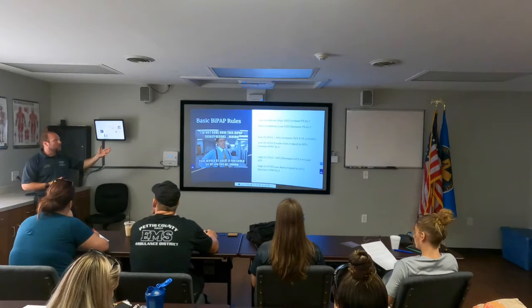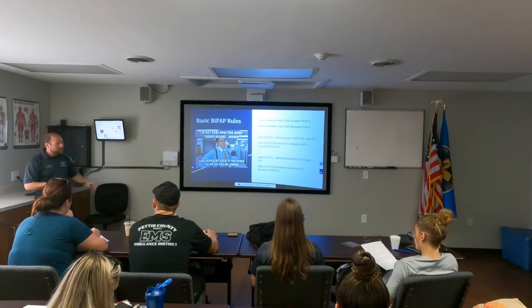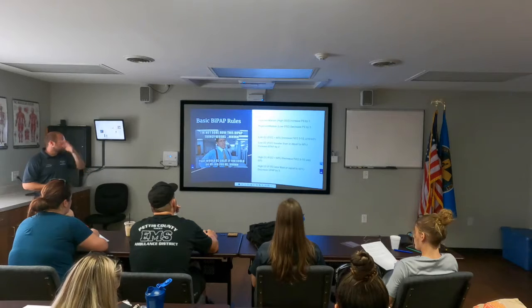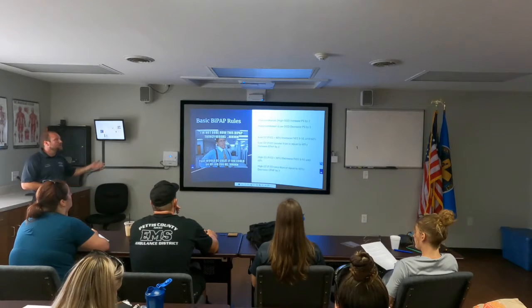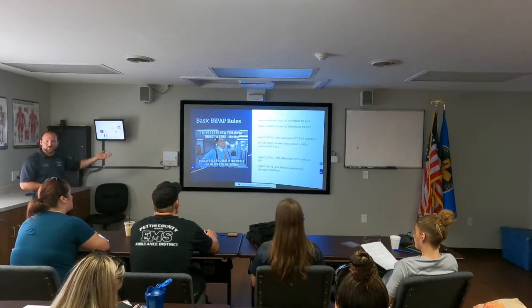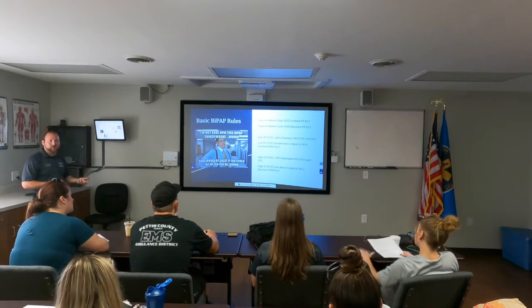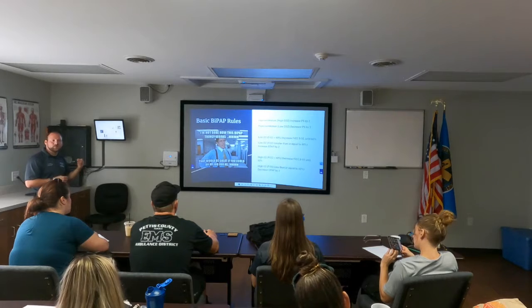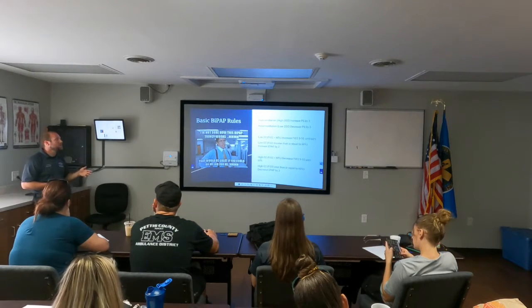about as far as BiPAP, first thing to start off is we want to know, is our pressure support appropriate? So we look at their end tidal, or we look at their PaCO2 on their ABG. Is it going to be high? We're going to increase our pressure support by 2. Is it low? We'll decrease it by 2. Always work in small increments when it comes to the vent, because small changes equal big results.